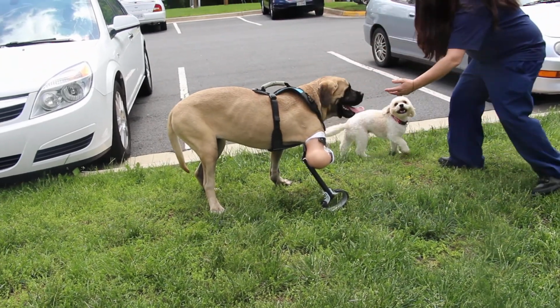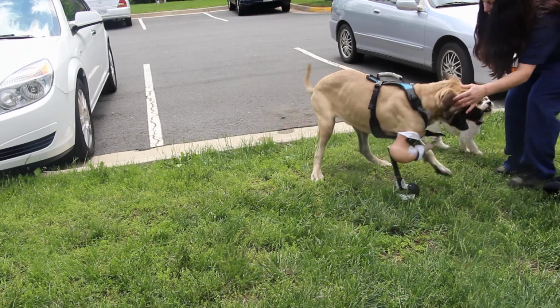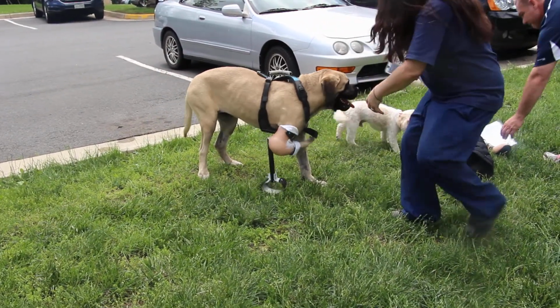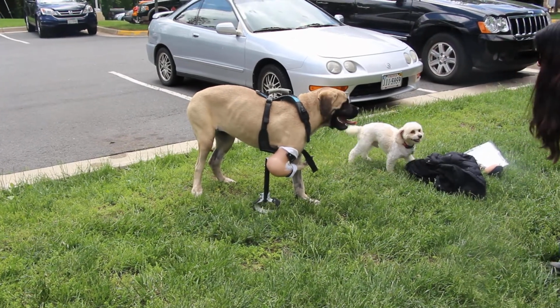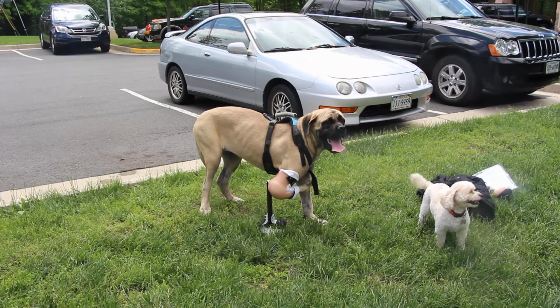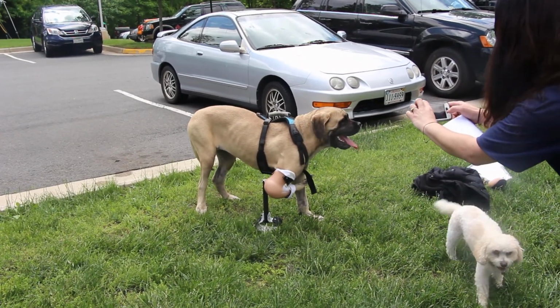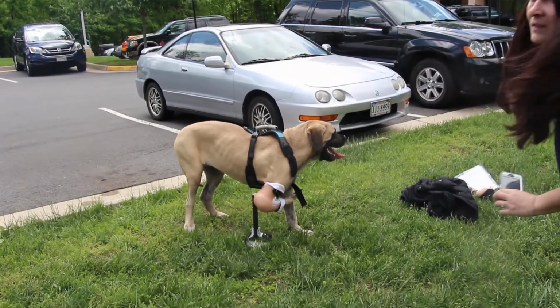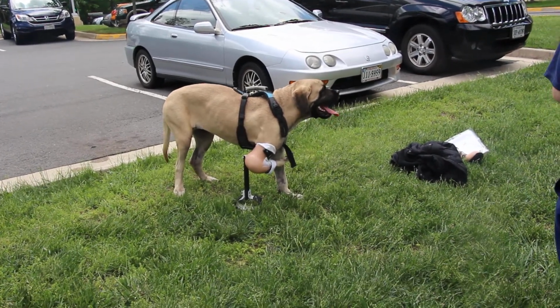Well, that's when I did the initial evaluation. She was kicking the leg out forward, which means she wants to use the leg. Right. Yeah, that was really good. So that means she's a better candidate. If dogs just keep their leg back and tuck it up, it's almost too far gone. Right. And when she's in her chair, she would do the motion of that leg as it should have been. Yep. Perfect.